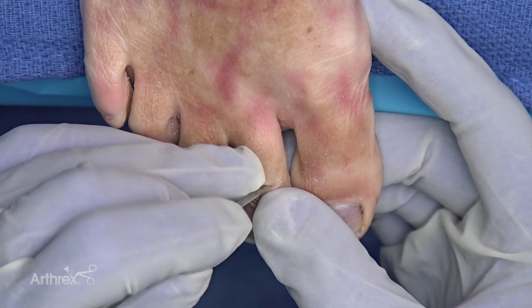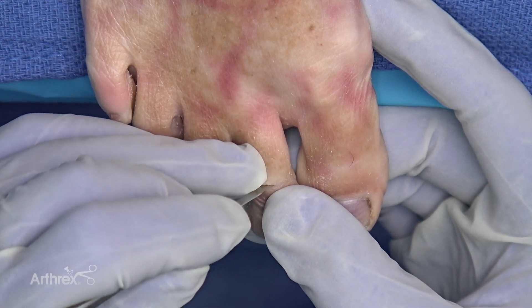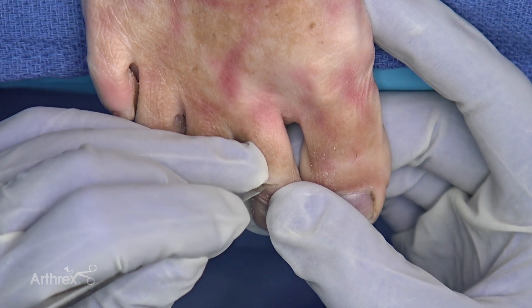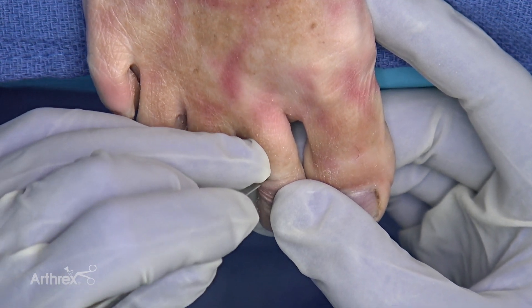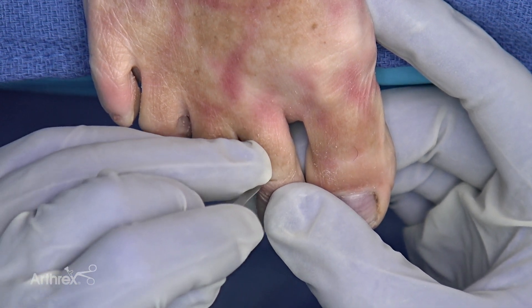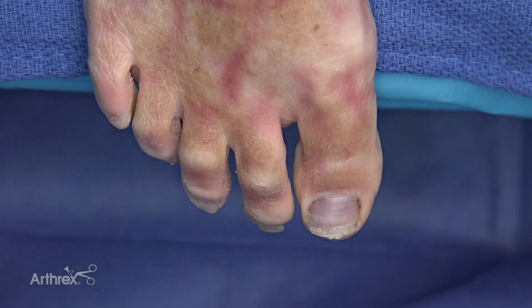Using the beaver blade that's part of the Arthrex MIS instrumentation set, we're going to make an incision through the extensor mechanism over the dorsum of the PIP joint, entering the joint as best we can. I'm taking care not to affect the medial and lateral neurovascular bundles.